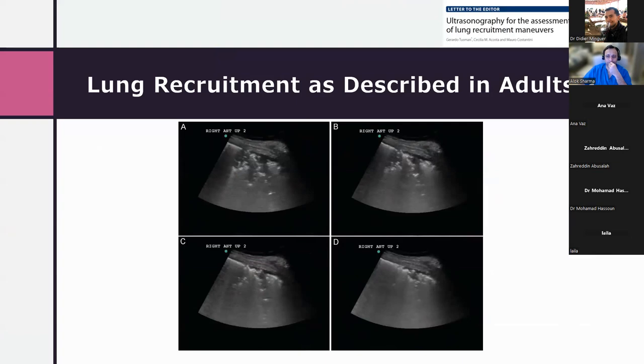I think obviously oxygen saturation is one of the important indicators of success, in addition to the direct imaging while the increments are going on. Okay. Anything else? You're absolutely right. Driving pressure, if that is improved, that gives me an idea.